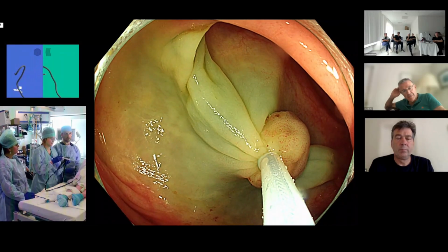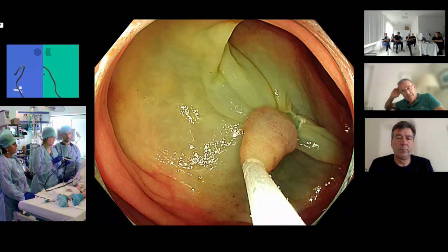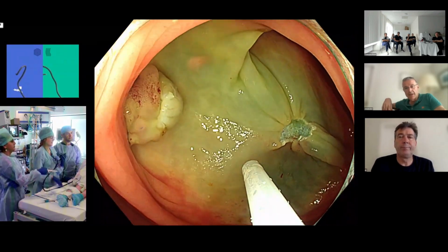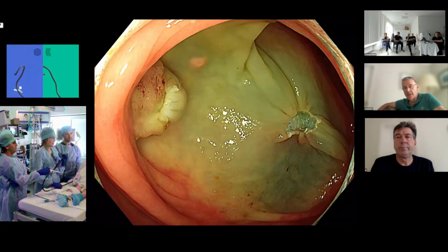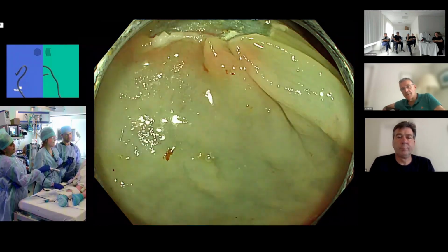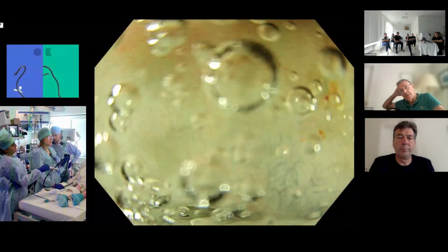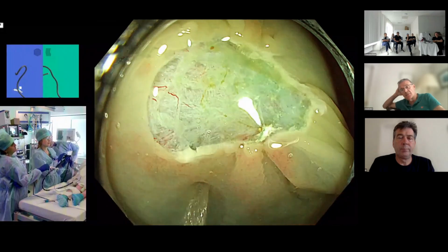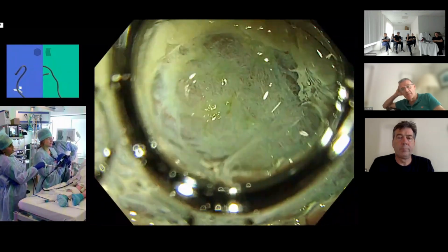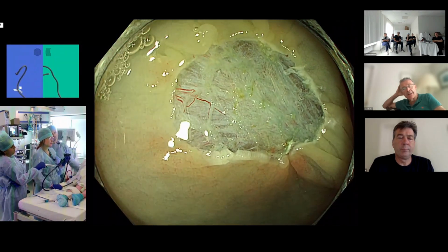Hand, right? Okay, go. Again. Perfect. Look at that, beautiful. Back to you, Roland. Right, so you need to just inspect the base, Delphine. You get close to it. You need to wash it, inject water, and go around the edge. You've got a perfect, very thin white rim around there. Can you see any residual adenoma? Just go right round the edge.